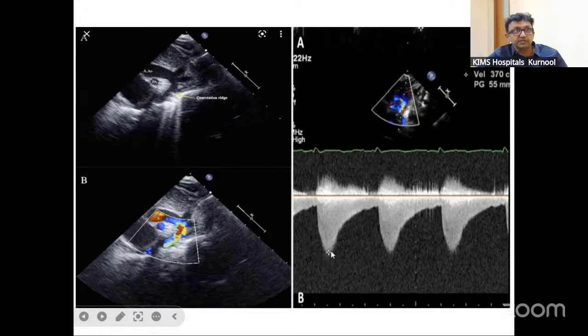Right? When you switch on the flow Doppler, this is the view that you get. It indicates that blood flow in systole is very rapid, while then the gradual emptying shows as the diastolic tail. In the diastolic phase, it is not emptying rapidly, but it is tailing slowly. So it is not fully emptying rapidly. There is slow emptying of the aorta. So this is called diastolic tailing. This indicates that there is some coarctation or narrowing in the aorta. So one, eyeballing, then with the color you see the turbulence, then with the flow you can see that there is diastolic tailing across that turbulent part.